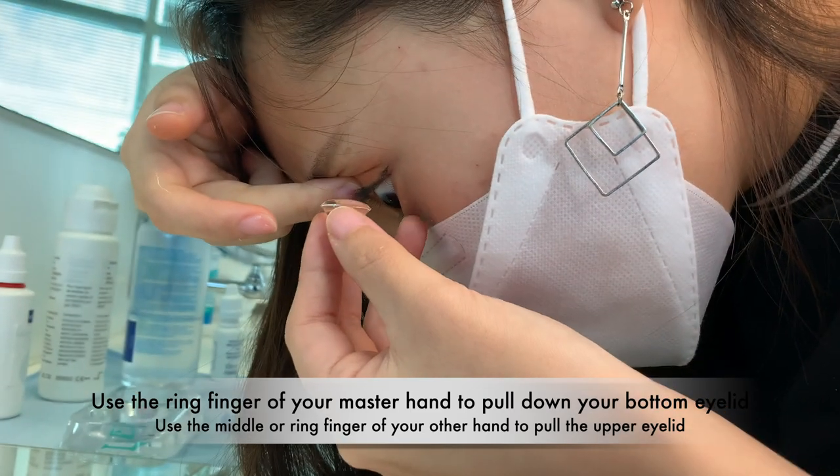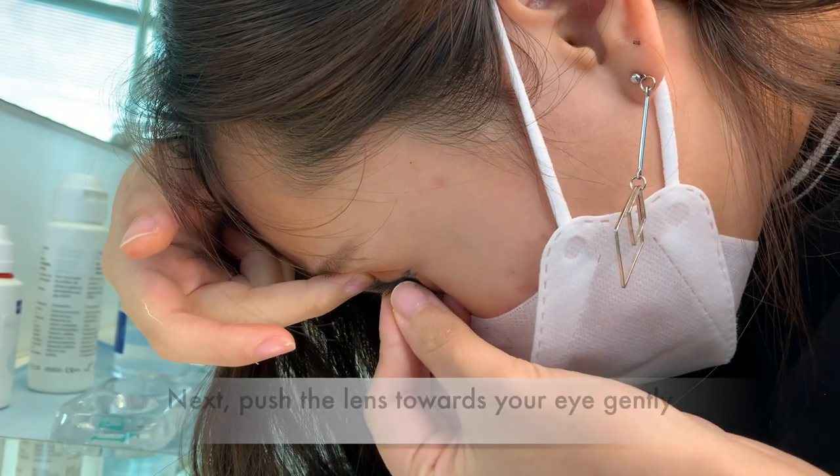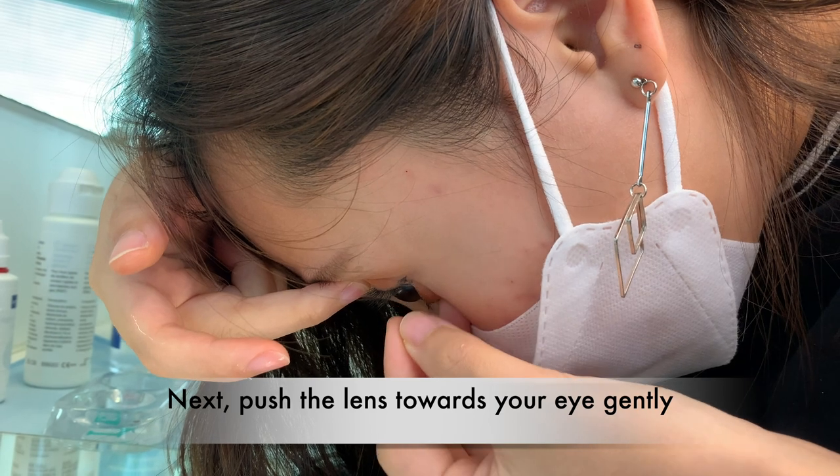Use the ring finger of your master hand to pull down your bottom eyelid, and use the middle or ring finger of your other hand to pull up the upper eyelid. Next, push the lens towards your eye gently.